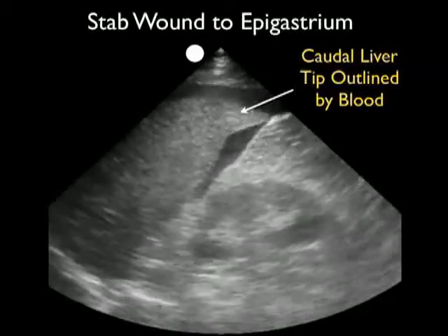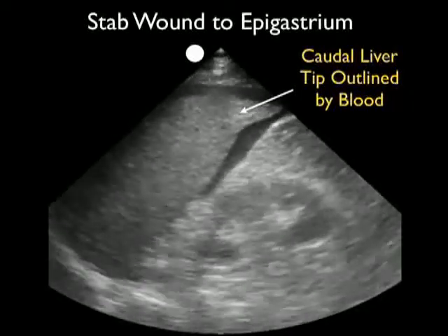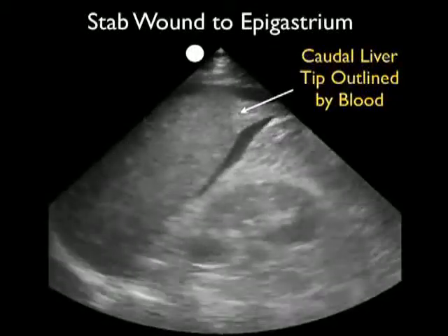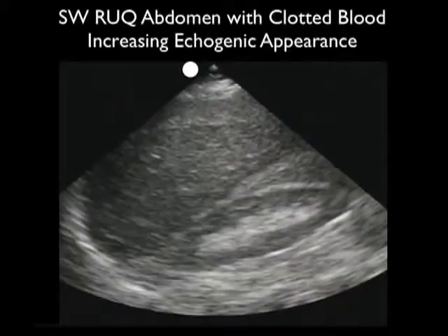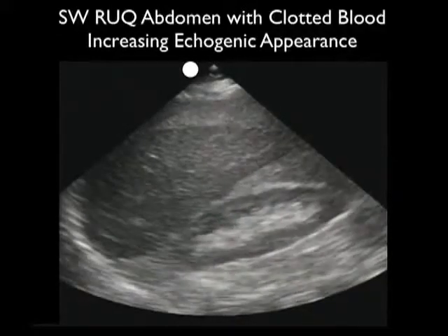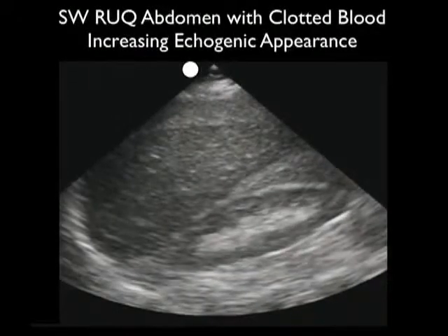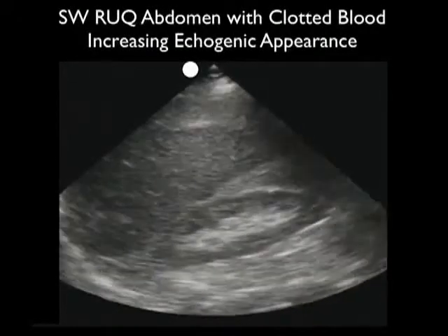I obtained this view by moving the probe one intercostal space inferior from the last view, to well delineate that caudal tip of the liver, which we can see moving around in all the fresh fluid. In the last few video clips, the appearance of fresh fluid on bedside sonography was dark or anechoic. However, as blood clots, it can take on a more echogenic or lighter appearance.